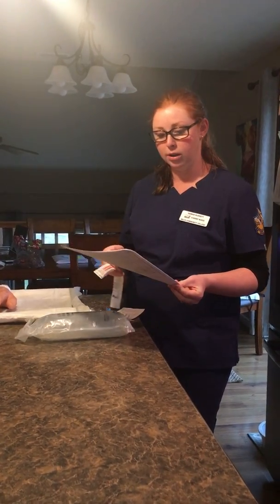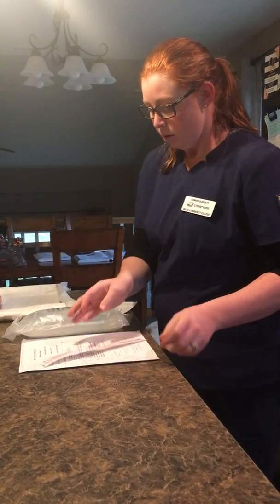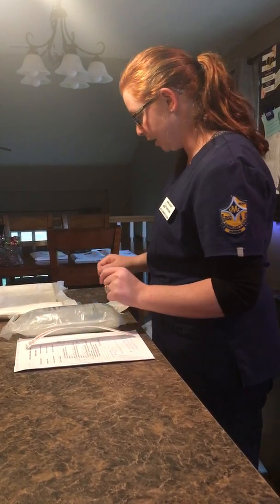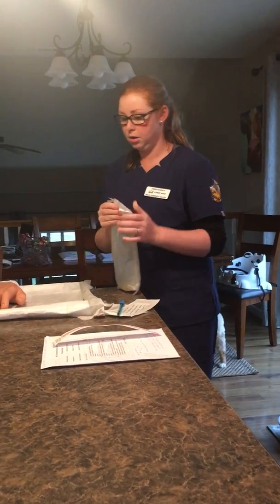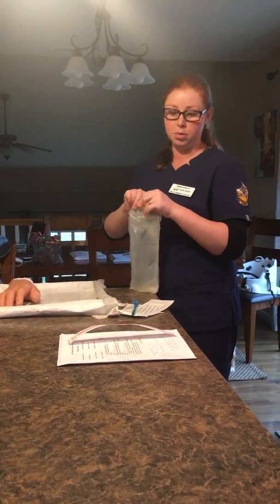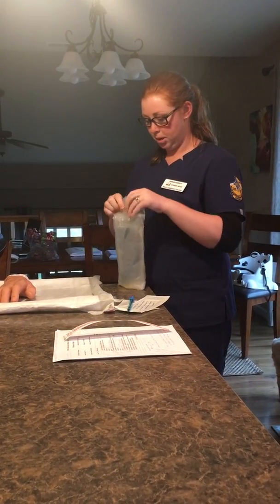So basically the way we calculated it out was the drop factor here is 10 for the tubing, which is 167 milliliters per hour, leaving us with about 7 drops per 15 seconds, or 28 drops a minute. So with all that being said, I'm going to go ahead and open my solution.